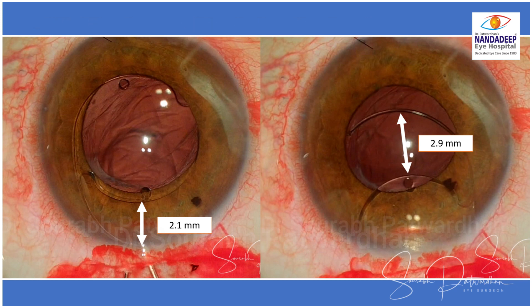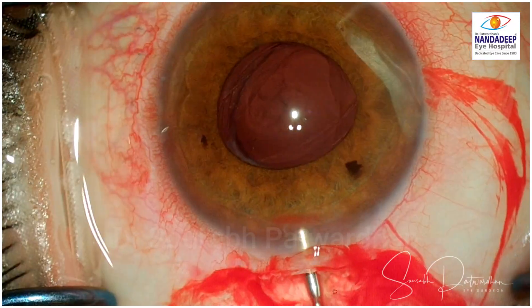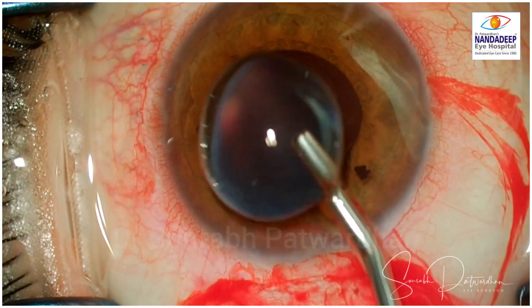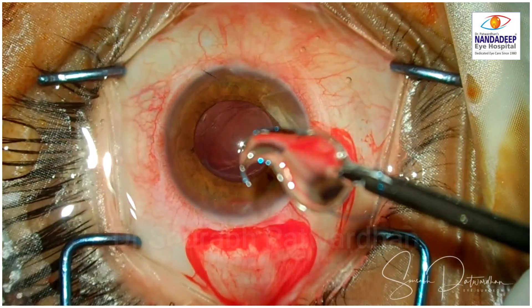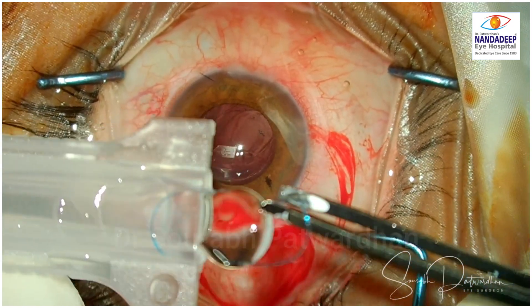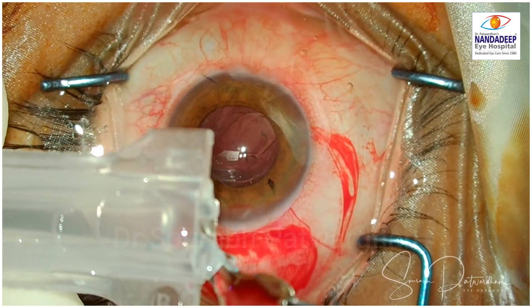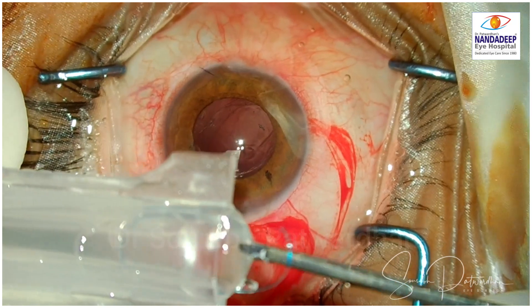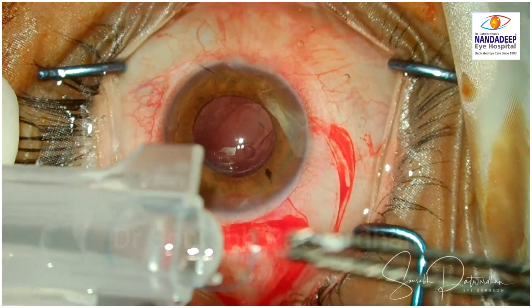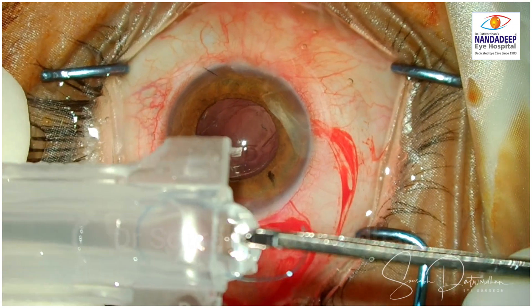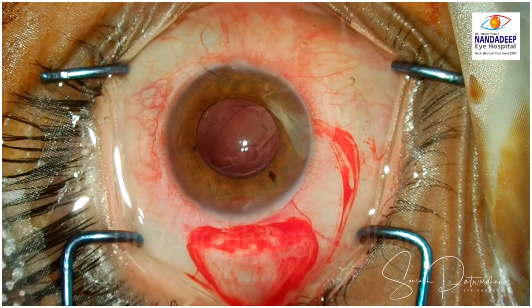This is probably why the IOL was decentered in this case — otherwise, if the haptics were good, this IOL would have centered very well. Now I am going to use a 3-piece foldable IOL; a 3-piece PMMA IOL will also do if available. PMMA haptics are much better for sulcus placement because of their springy action — they fit into the sulcus well.